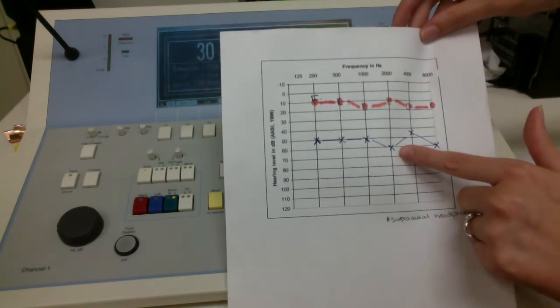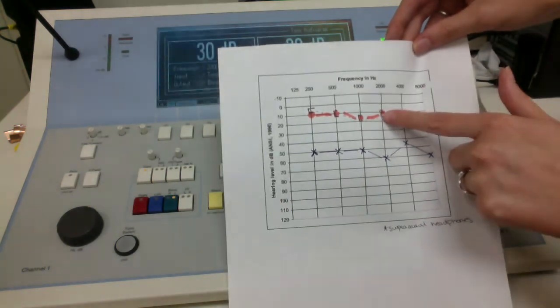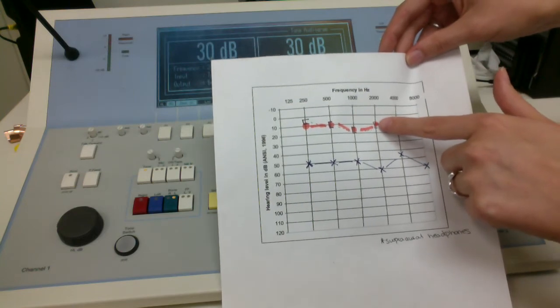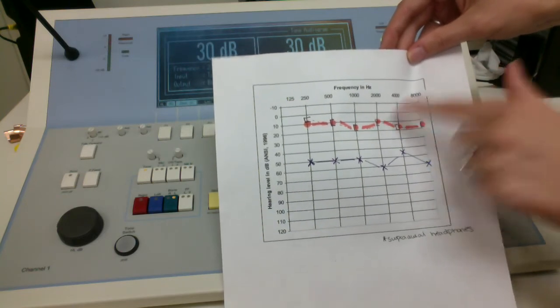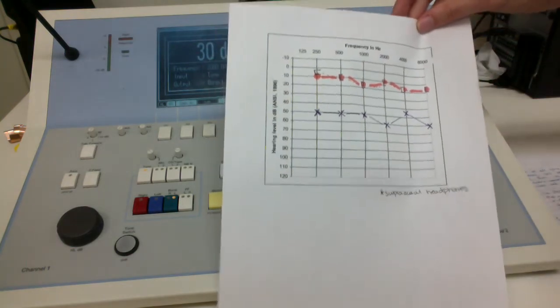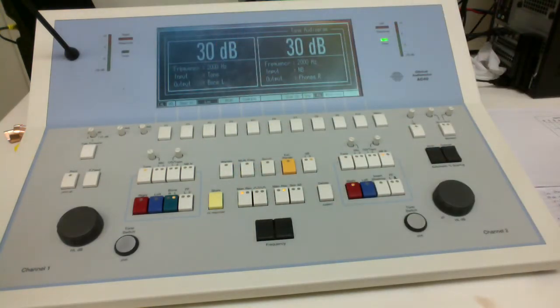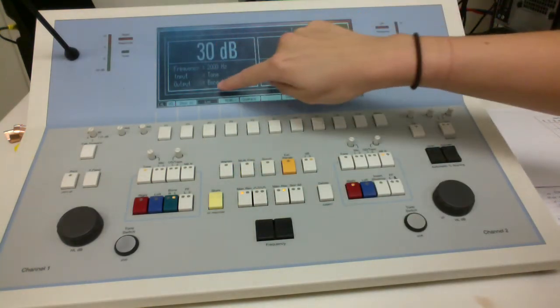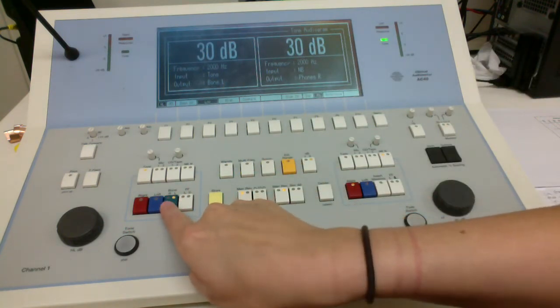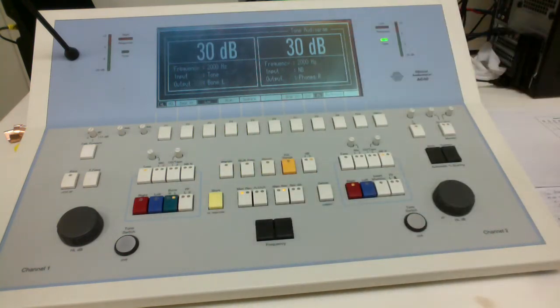So we're going to look here. 60 dB is our air conduction threshold for our left ear, and our bone conduction threshold, indicated by that right bracket in our right ear, is 10. So 60 minus 10 is greater than 10, so we do need to do some masking. We're going to go over here to 2000 hertz, and we're going to make sure that it's set on bone conduction left, and we change that with the green button there. So bone conduction left, this is our test ear.